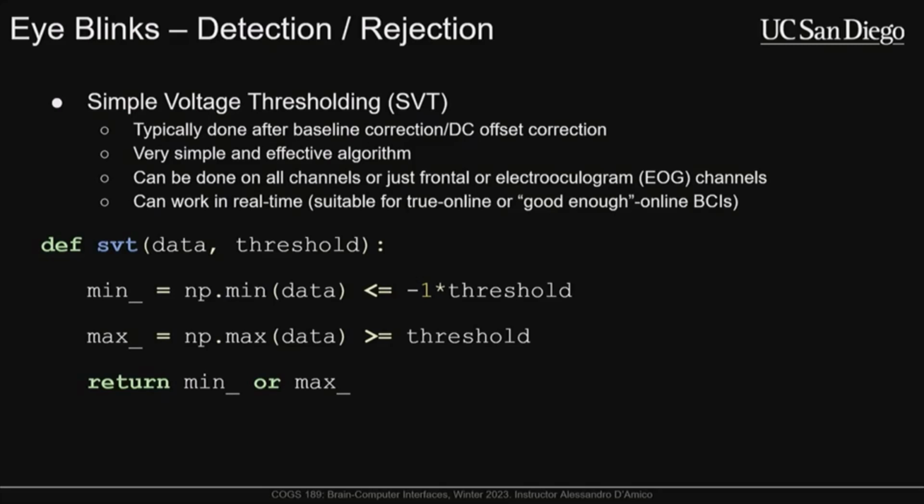Now you have to be careful because when you tell a participant to voluntarily blink, the amplitude of those blinks is going to be larger than when you just detect regular blinks. But you could mitigate that by having a 1 or 2 minute period where you tell the person, hey, we're going to record some resting EEG. Just look at this fixation cross for a minute, and then you can use the activity from those blinks as thresholding, and you could do that automatically as well.